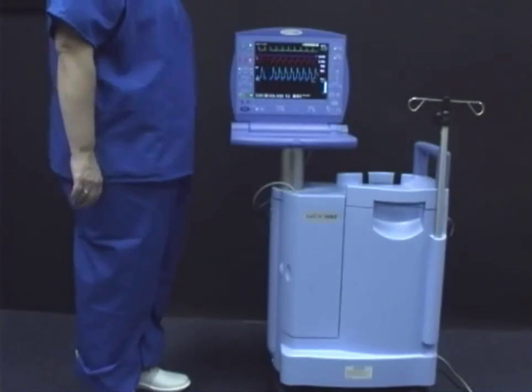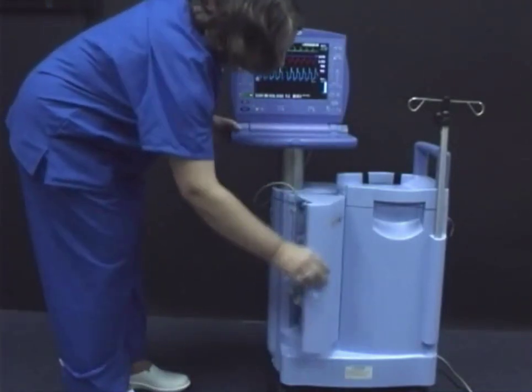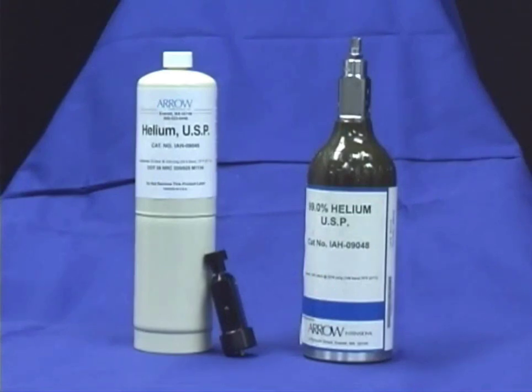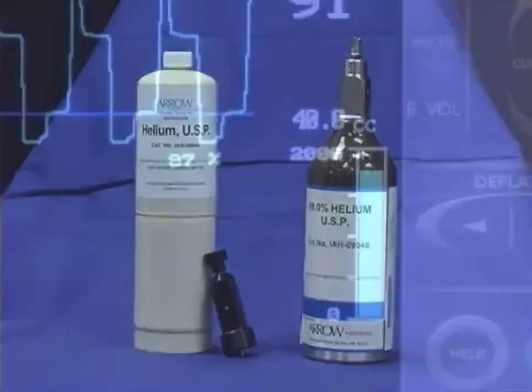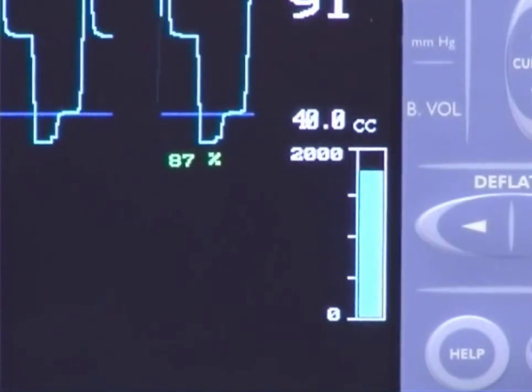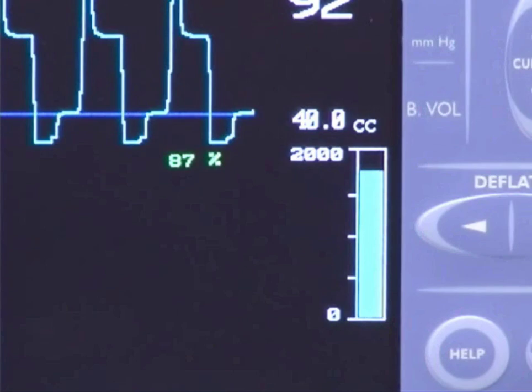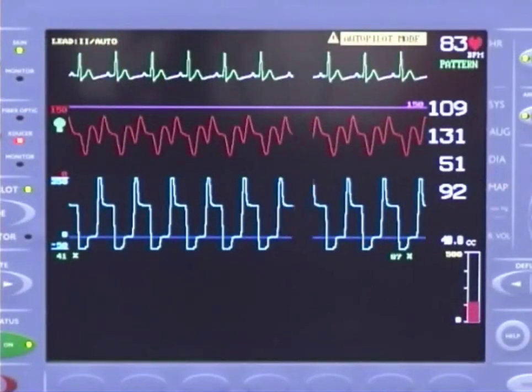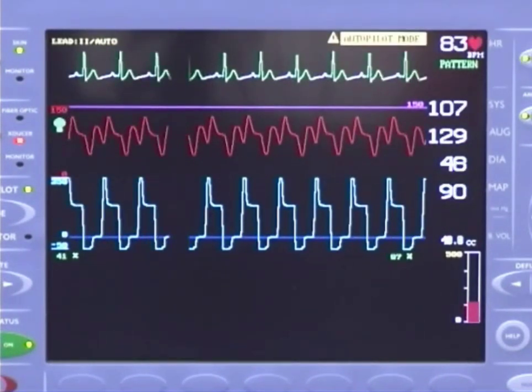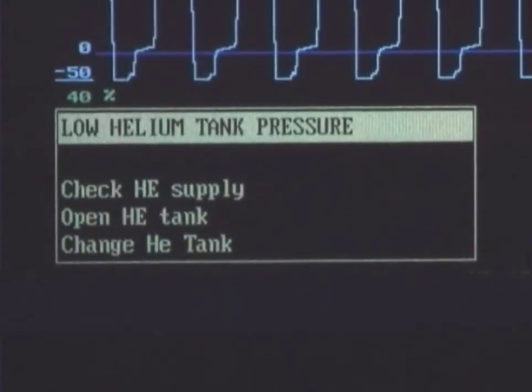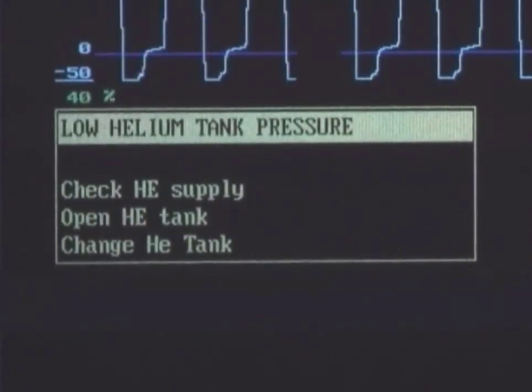The helium tank is located in the compartment on the left side of the pump. The AutoCAP II series can accommodate either a 500 PSI disposable or 2,000 PSI refillable helium tank. A special adapter is included for the 500 PSI tank. The helium gauge is displayed by the blue bar graph on the screen. When the pressure in the tank goes below 125 PSI, the bar turns red — that is your indication that within the next several hours you should change the tank. If this indicator is ignored, the pump will alarm when the tank is empty.